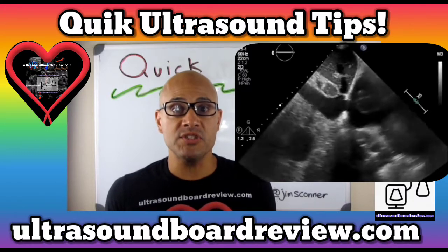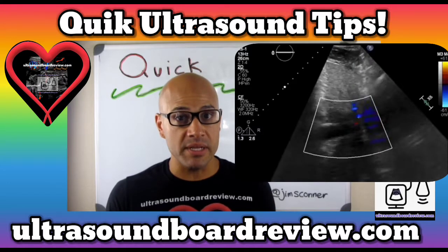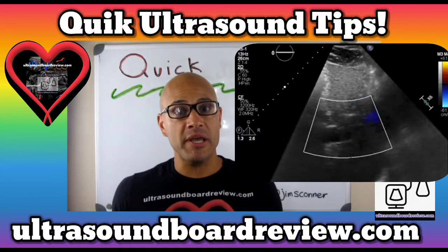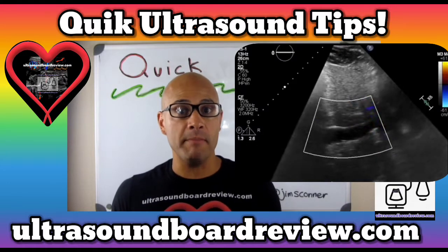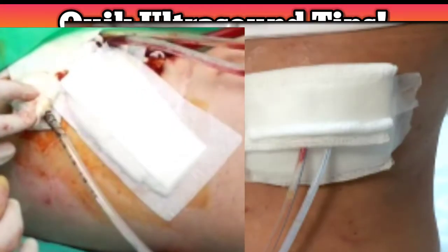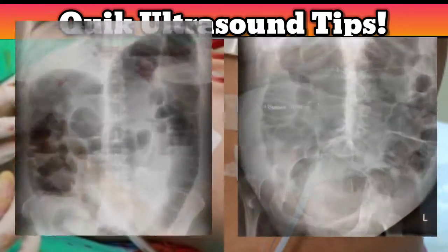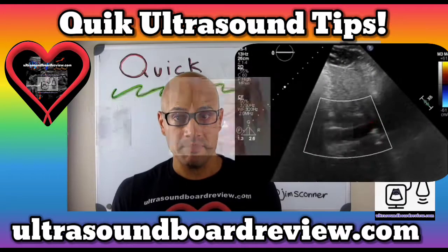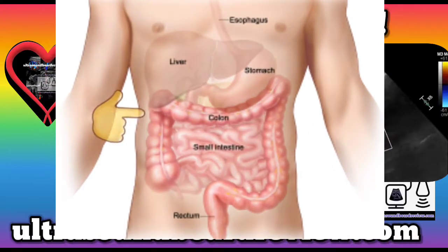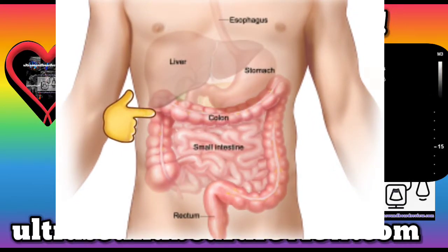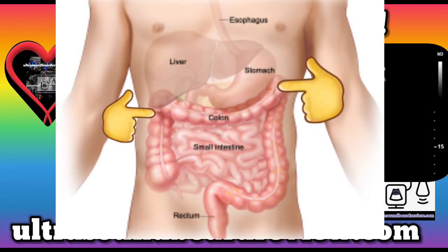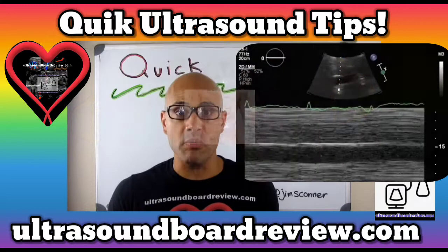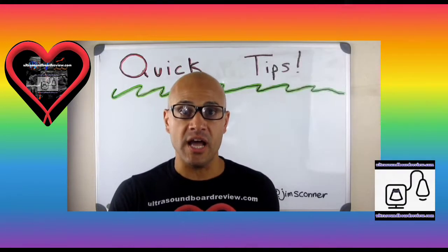But sometimes the IVC's visualization is limited — either because the patient has post-op open wound bandages, or when the patient has excessive amounts of bowel gas distending the belly. The transverse colon or the stomach can get in the way when we're trying to visualize the IVC.